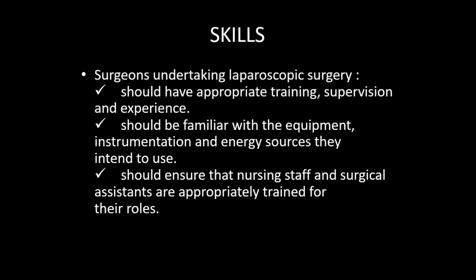All of you should remember that surgeons should have appropriate training and supervision with experience, be familiar with equipment and instrumentation, and ensure that the instruments are all working well prior to starting the procedure.